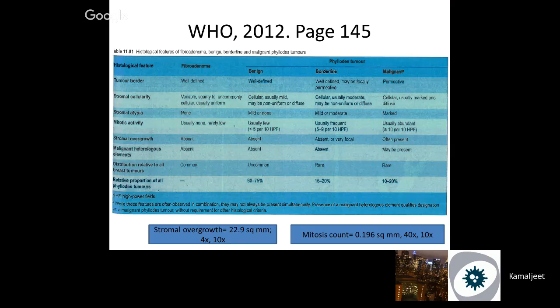So we'll just go over a few cases and see how we get to this grading of phyllodes. I'm not going to show you a fibroadenoma because we see fibroadenomas a lot, but phyllodes are rare and we don't see as many.